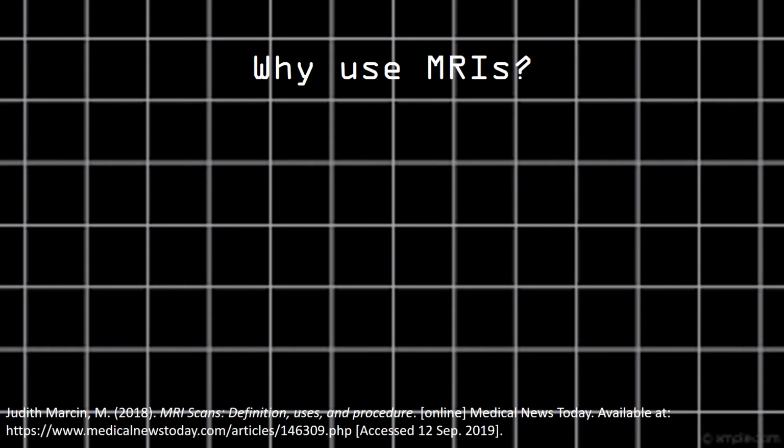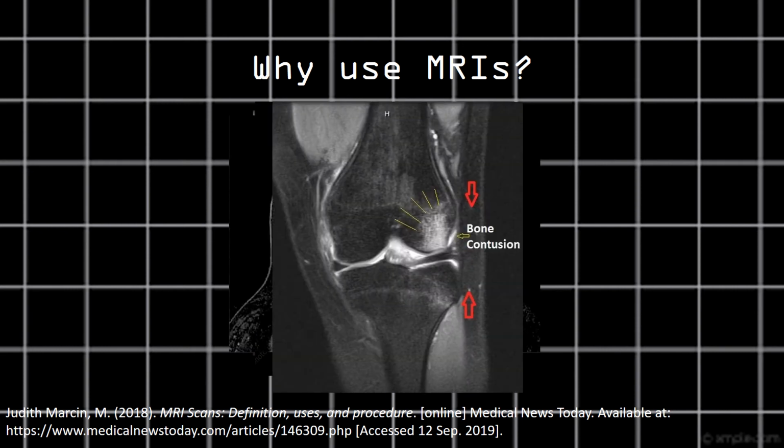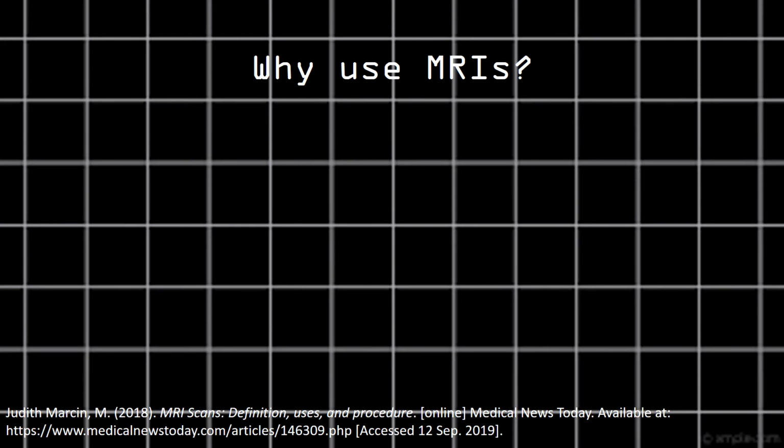Using this technology, radiologists are able to scan for a multitude of diseases within the body and provide well-informed prognosis. MRIs scan for brain and spinal cord anomalies, tumors and cysts, breast cancer, joint injuries, heart problems, and liver and abdominal diseases, just to name a few.